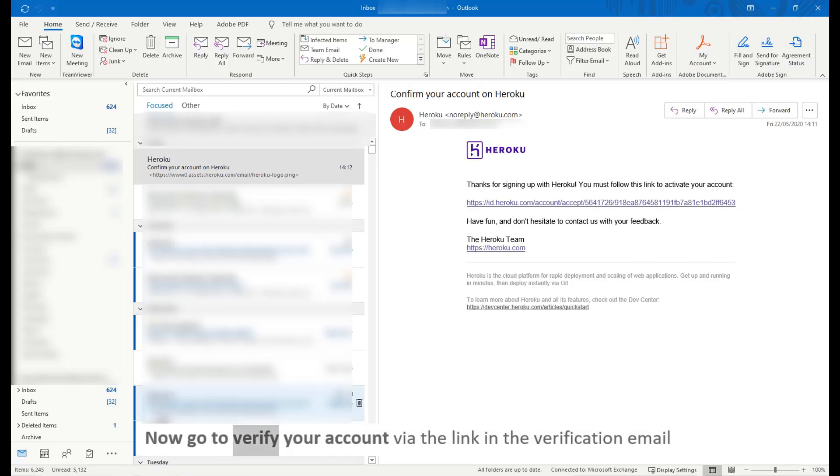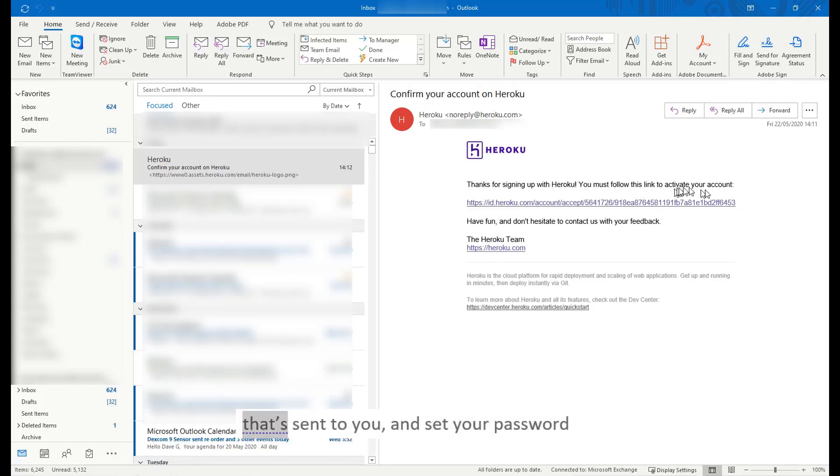Now go verify your account via the link in the verification email that's sent to you, and set your password.